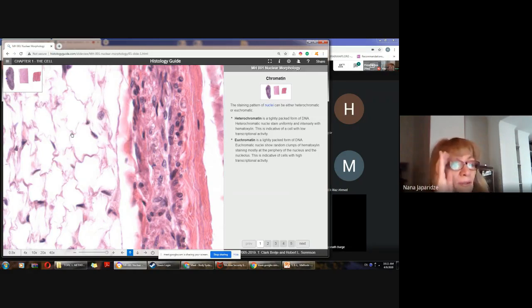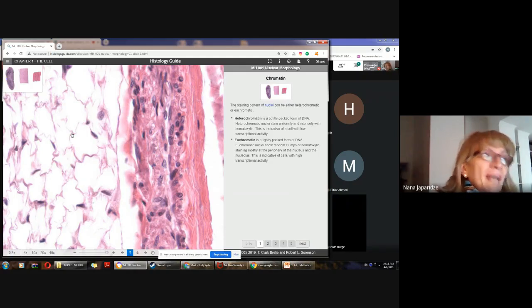You know, when you study adipose tissue, you will know that adipocytes are filled with one big droplet of fat. And that whole amount of cytoplasm and nucleus is dislocated to the periphery.